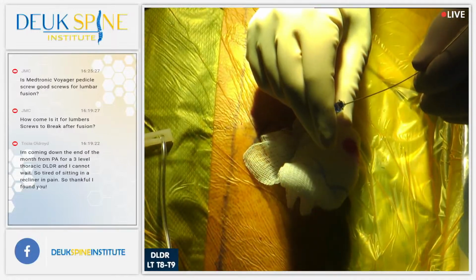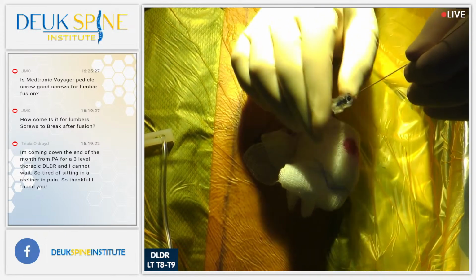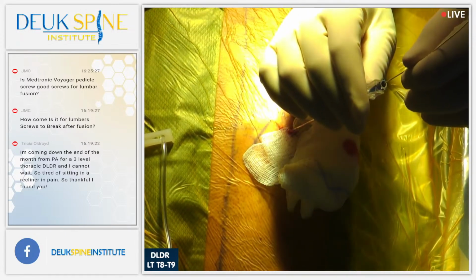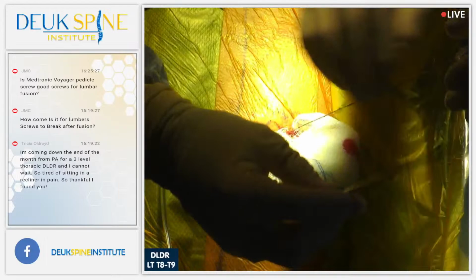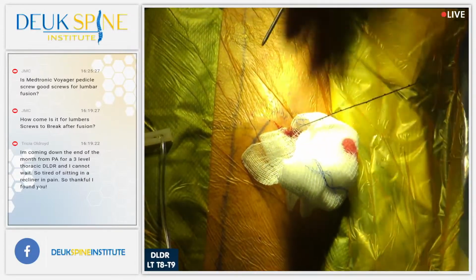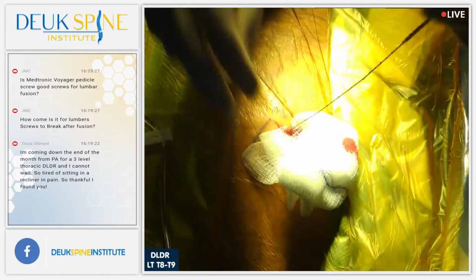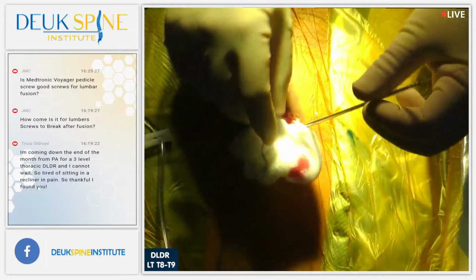That's a 4mm incision I just made. Shot. Now I've got to take this needle out but leave the guide wire. Shot. Okay, good. You guys see that? The guide wire is staying. The guide wire's purpose is to guide me. I'm going to guide this dilator in so we can do the surgery. But we'll take the question.